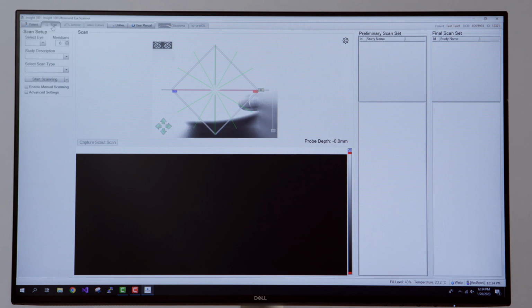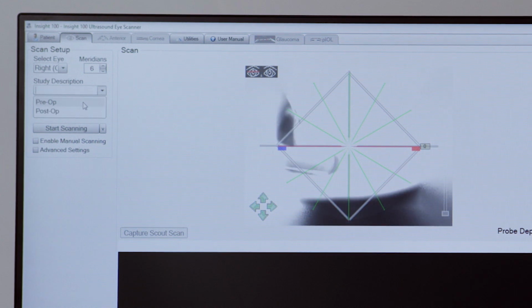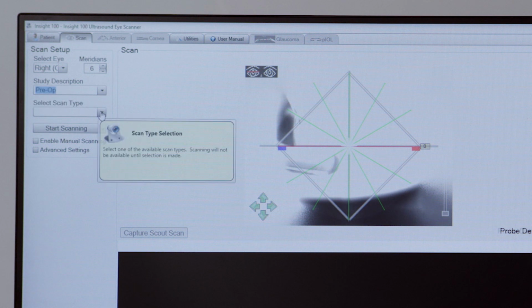Once the patient information is set, go to the scan page. You're required to select right or left eye, pre or post-op, and you can also free type in this field. Then select Scan Type.